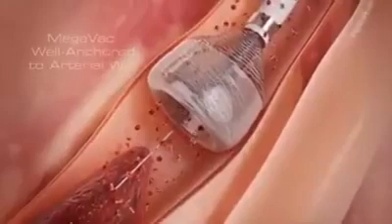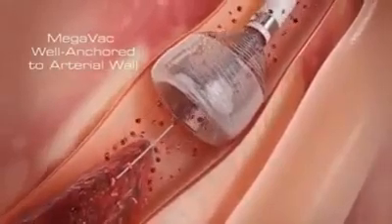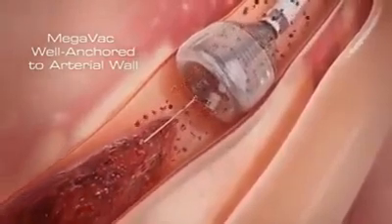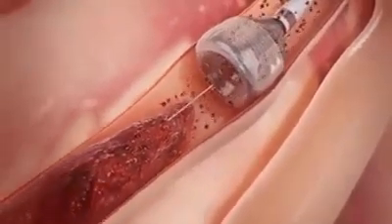The outward expansion of the Megavac anchors and centers the device, and can be used as an anchor for other devices in crossing tight lesions or tortuous vessels.